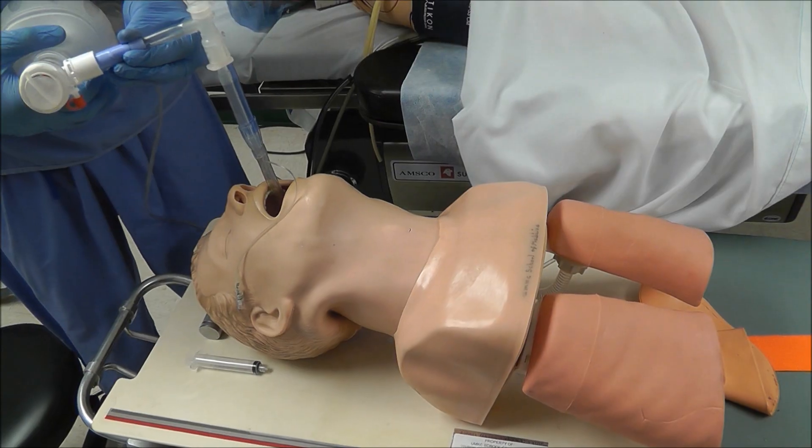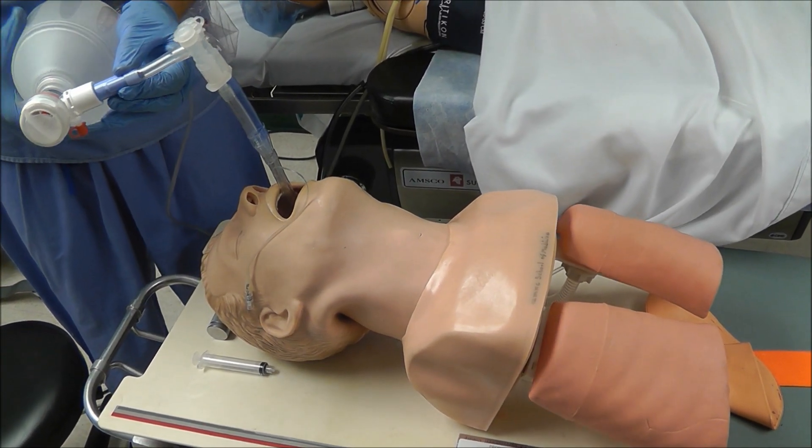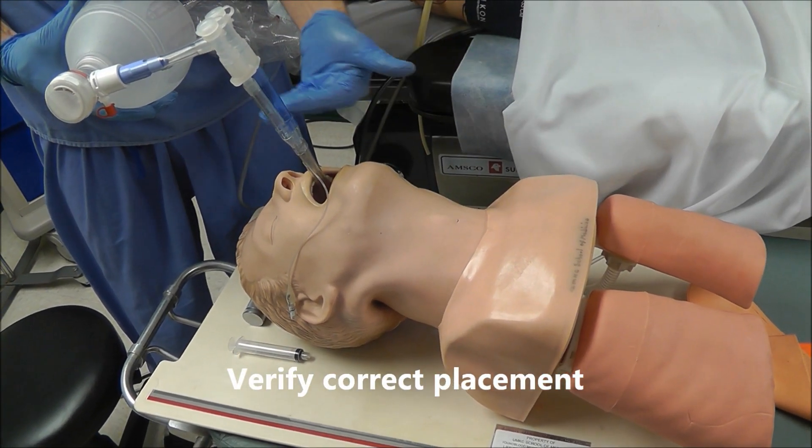Now it's time to ventilate the patient. Once you can verify that you can ventilate the patient, we need to check to see whether or not the tube is correctly placed.